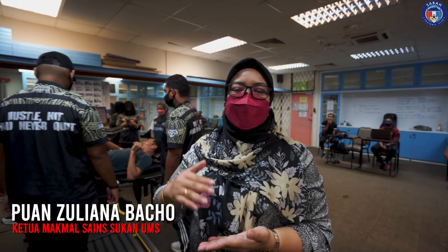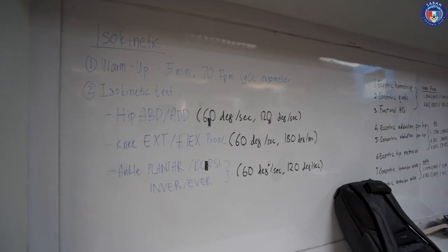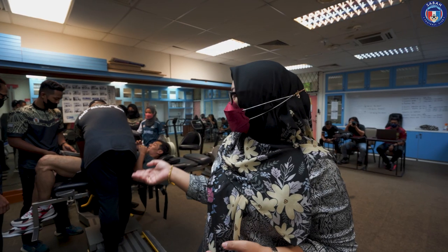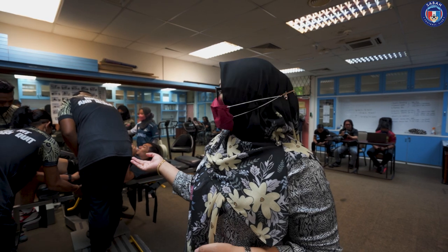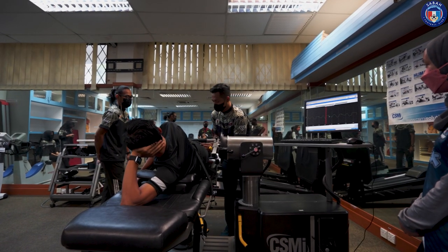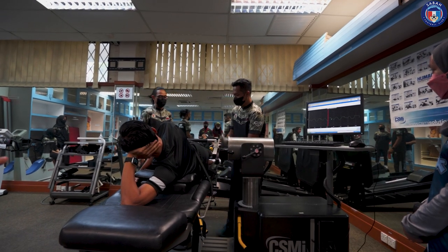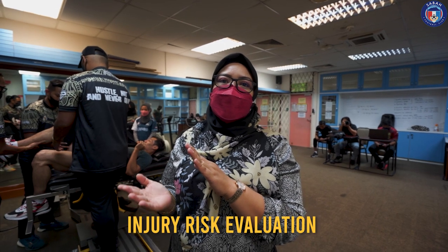Testing ini kita akan melibatkan 3 joint: bahagian hip, pinggul, knee, lutut dan juga ankle. Kita akan buat testing — kali ini kita buat concentric untuk quadricep, kita tengok di bahagian hip. Kita akan gunakan machine untuk mengukur kekuatan dia. Nanti kita akan nampak sekiranya terdapat perbezaan kekuatan antara quadricep dan hamstring. Daripada data tu, kita boleh nilai sama ada risiko untuk pelaku kecederaan tu tinggi atau tidak.